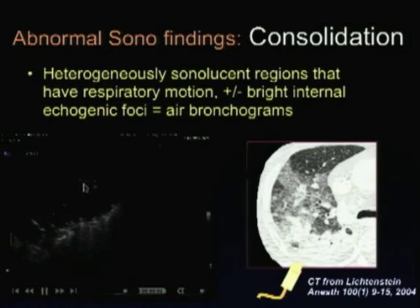One can see the pleural line right here, and underneath this area of consolidated lung filled with these white lines that move with respiration continuously, don't disappear, which makes one know that they're tubular structures. It turns out these are air bronchograms as seen on ultrasound.